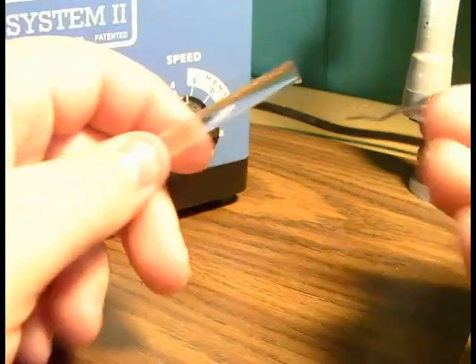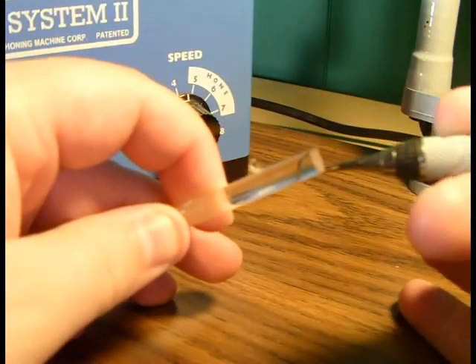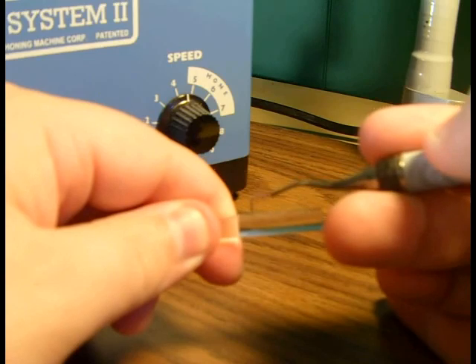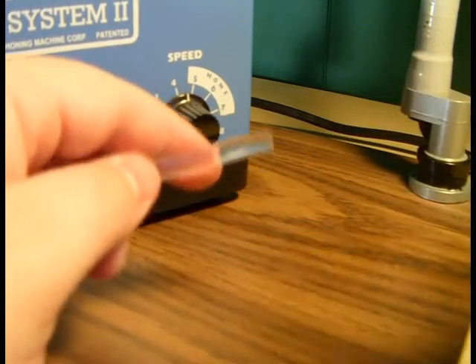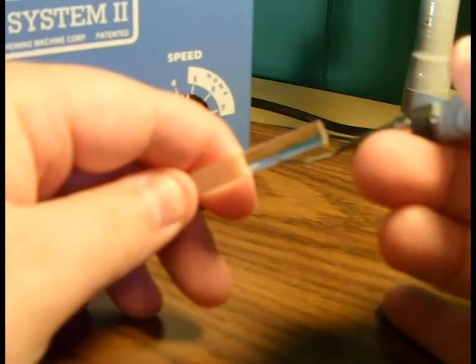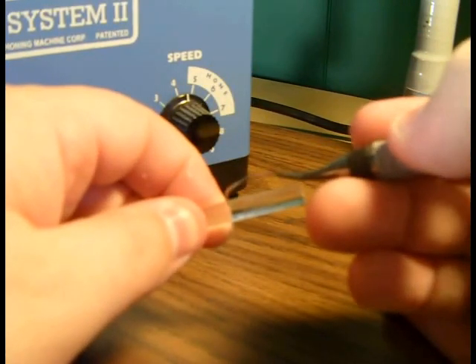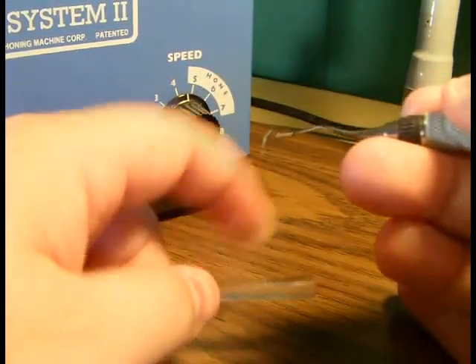Just like with the scaler, we're going to test the curette. We're going to check that it has a nice sharp edge on both sides, and also we're going to make sure that the tip is sharp. Now, we're going to go back and show you how to sharpen the tip in just a moment. But this is something you still want to check, because not only is that tip supposed to be round, it's supposed to be sharp. So make sure that it grabs the plastic just like the edge of that curette does.